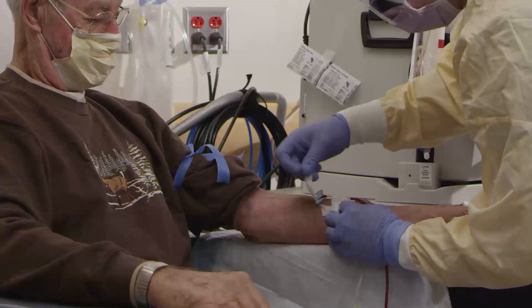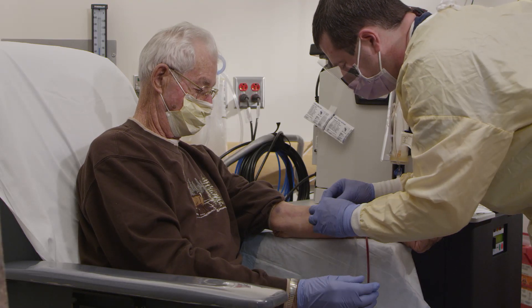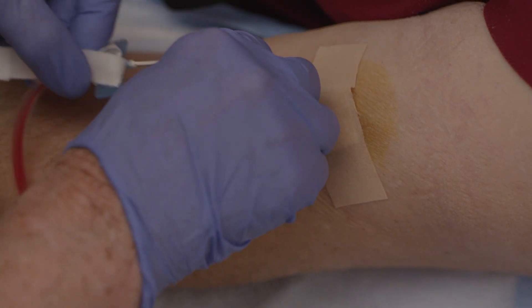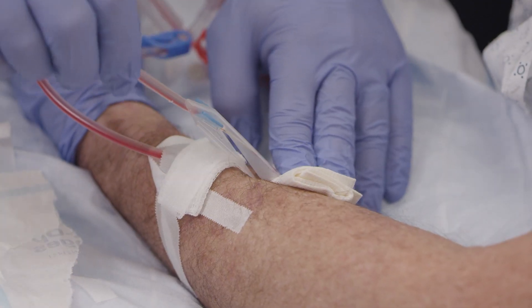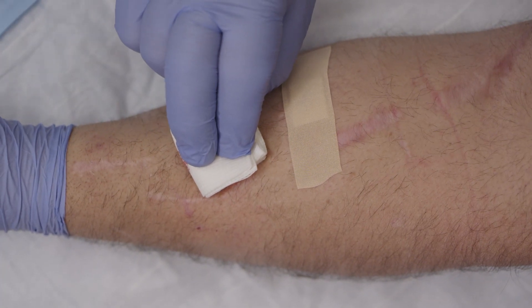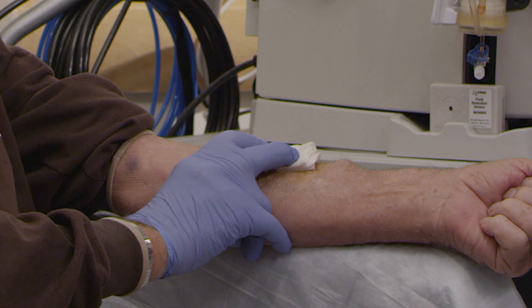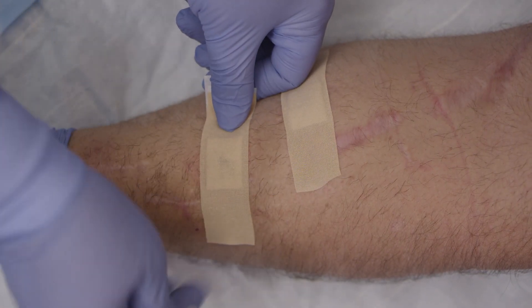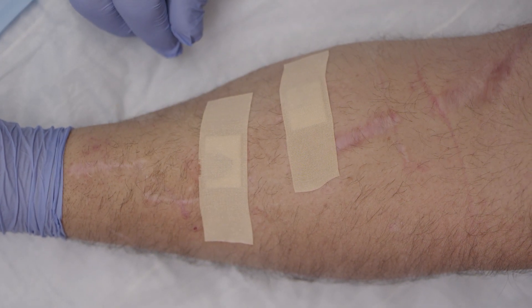Ensure that the access site is visible during the dialysis treatment. To remove the fistula needles after the dialysis treatment is complete, put on clean gloves. Remove needles at the same angle of insertion using one fluid motion. Remove only one needle at a time. Use the anti-needlestick safety device as appropriate, and wait to apply pressure to the site until after the needle is removed. It is best to use two fingers to apply pressure over both the vessel and puncture site. After bleeding has stopped, cover the sites with adhesive bandages or gauze and tape. Do not place tape completely around the access extremity. Remove dressing as instructed by your center.